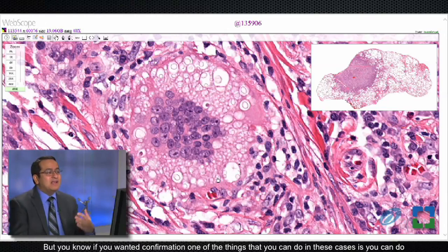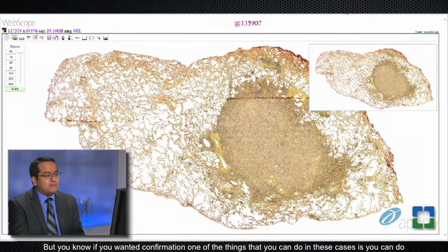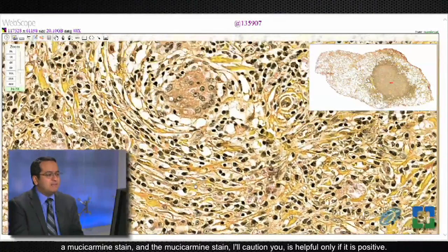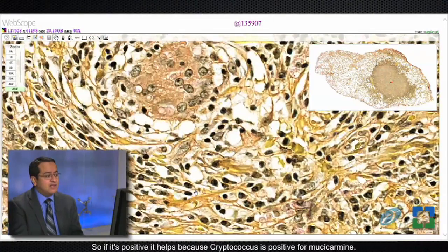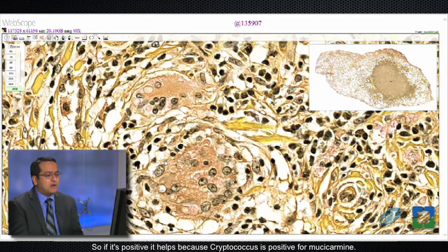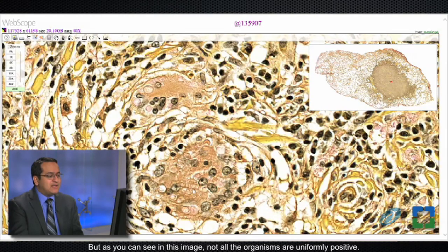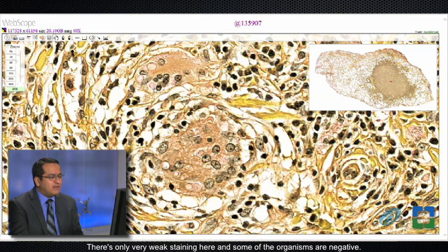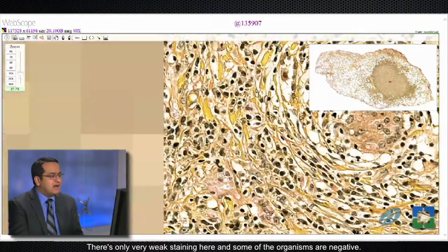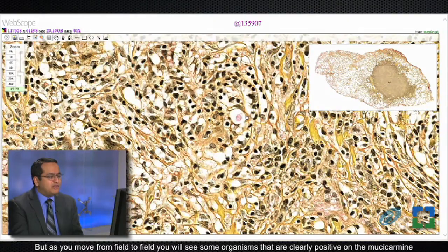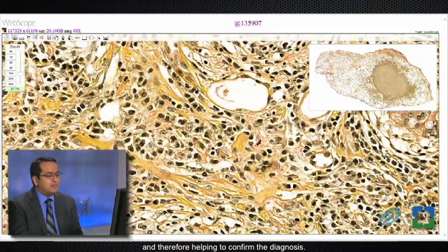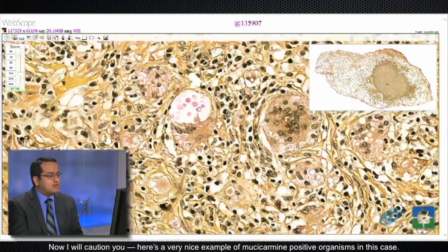For me, this is cryptococcus right on the H&E — I don't need a GMS stain, I don't need cultures, I don't need anything else. But if you wanted confirmation, one of the things you can do is a mucicarmine stain. I'll caution you that the mucicarmine stain is helpful only if it is positive. If it's positive it helps, because cryptococcus is positive for mucicarmine. However, as you can see in this image, not all the organisms are uniformly positive — there's only very weak staining here, and some of the organisms are negative. But as you move from field to field you will see some organisms that are clearly positive on the mucicarmine.